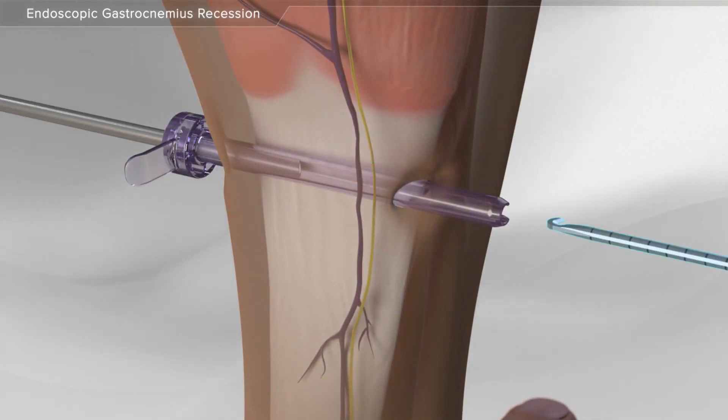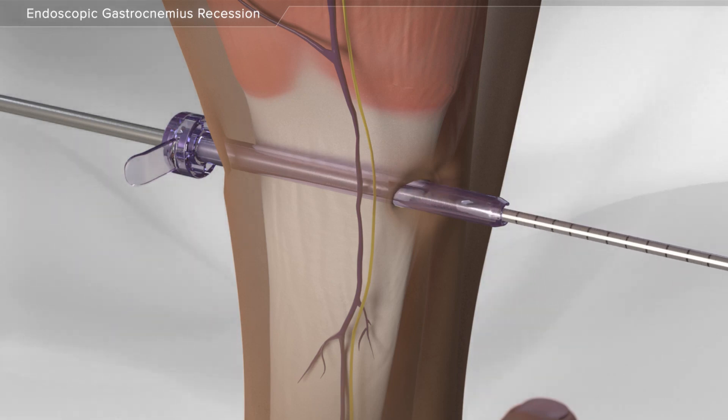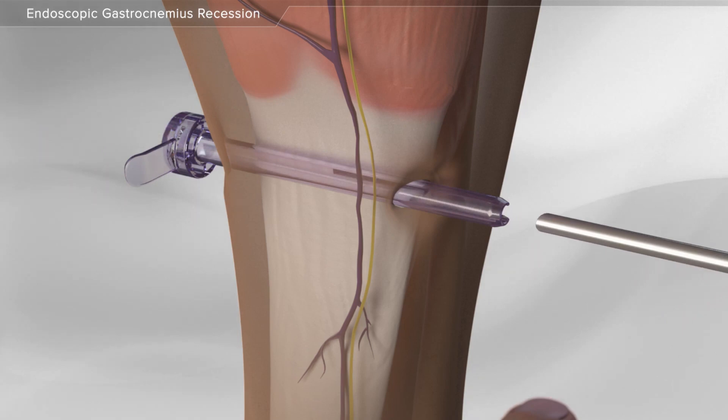With the use of a special blade, the muscle can be released under direct visualization. First, one half of the muscle is released, followed by the remaining muscle.